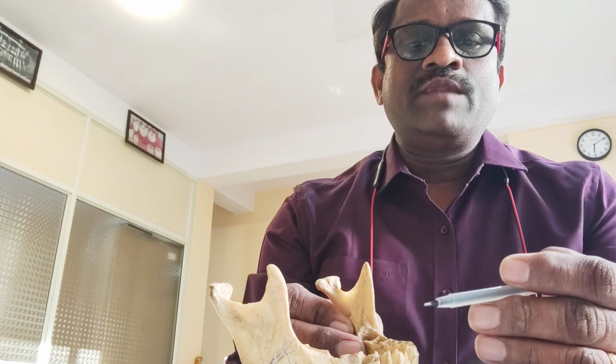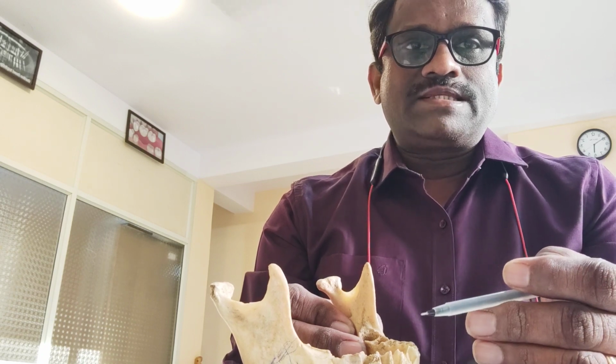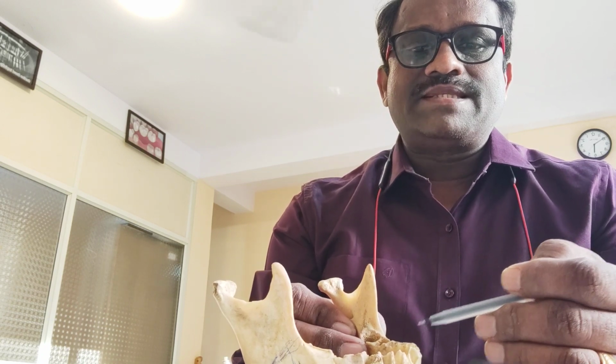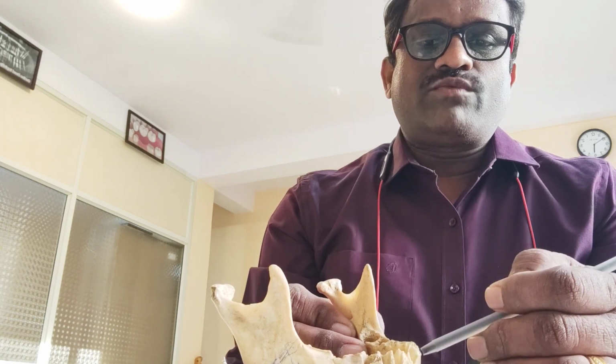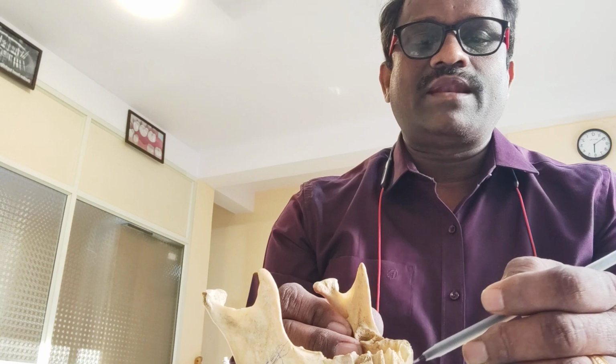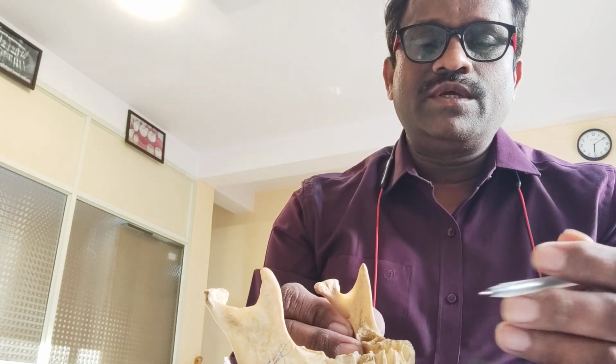Whereas in basal implantology, we have come up with single piece, cone shaped implants, which we call King of Corticals or BCS implants. We can place these implants in the atrophied mandible, and we can bypass the mandibular canal, or inferior alveolar nerve.